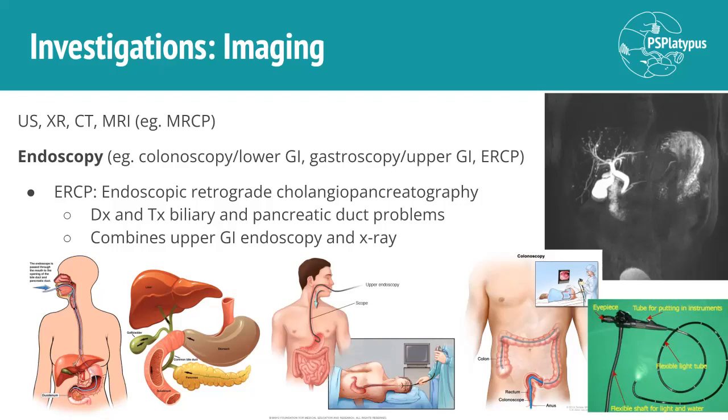And you can basically use it to look, diagnose, and also treat. So there are different tools you can have on the end of your endoscope. And so you can sort of break gallstones and things like that.